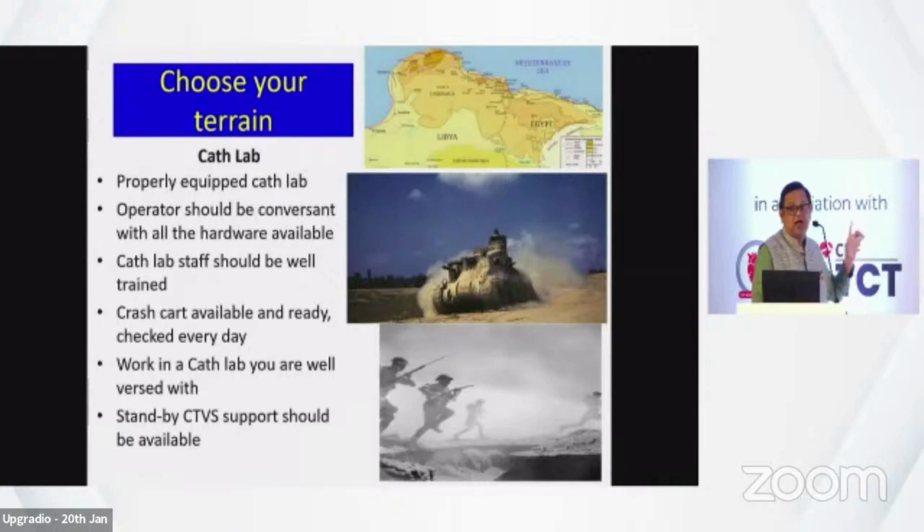The cath lab staff should be well trained, including yourself. The crash cart should be available nearby. Always, before starting the procedure, check whether the defibrillator is working and whether the crash cart is available or not. And also make sure, if possible, that CT surgery-based support is also present.